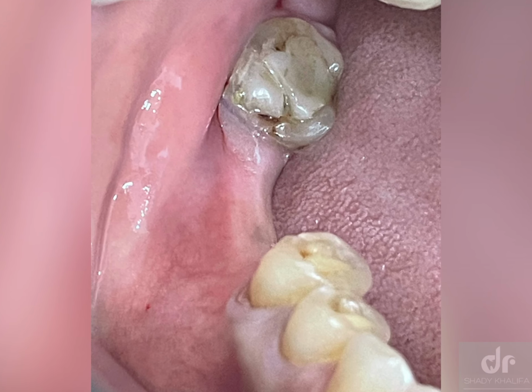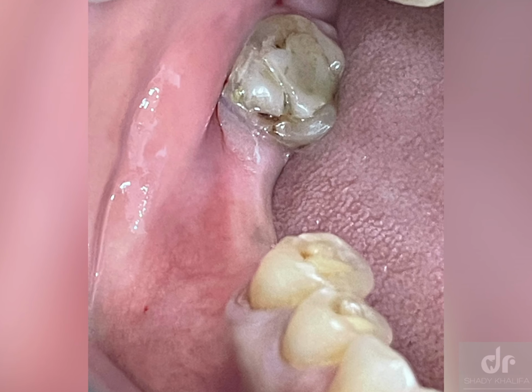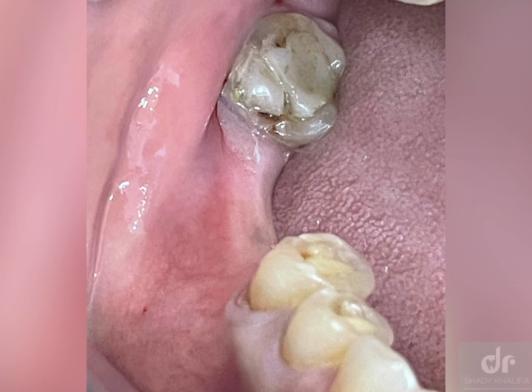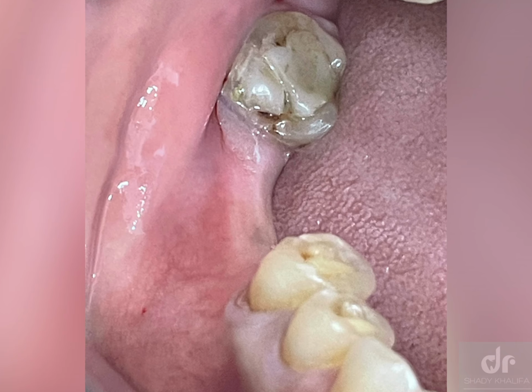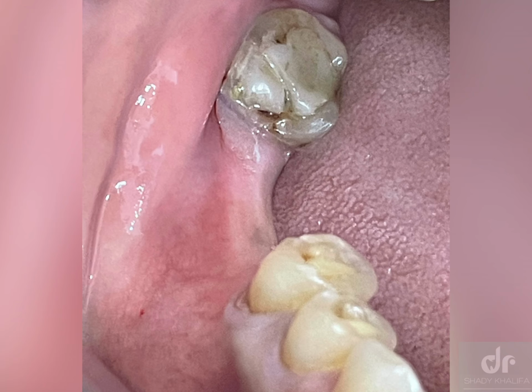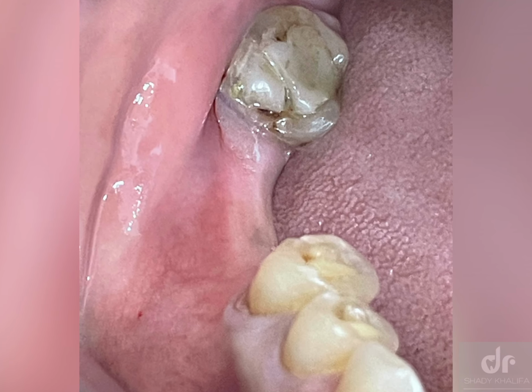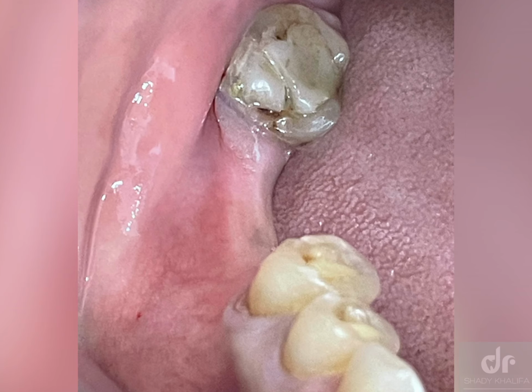The height we can take from the OPG or the panoramic, but we can also see it well in CBCT, the length, the height, and the buccolingual width. So we advise everyone to use it if he has it.